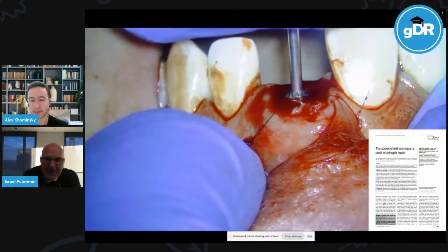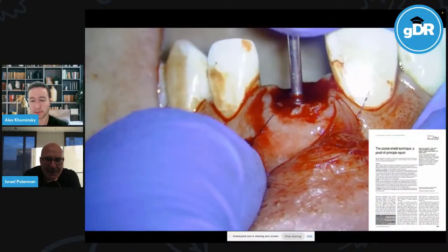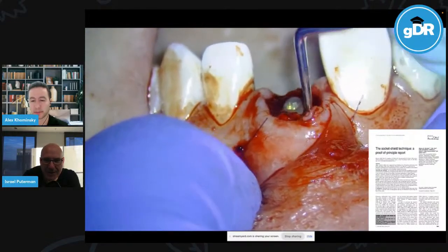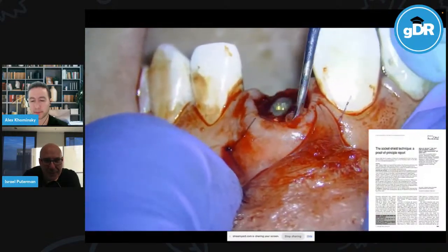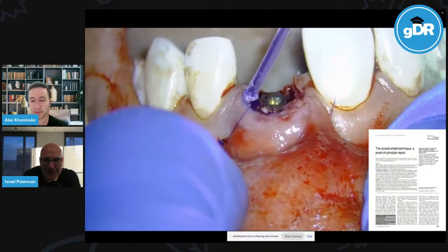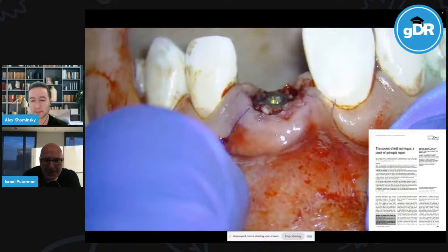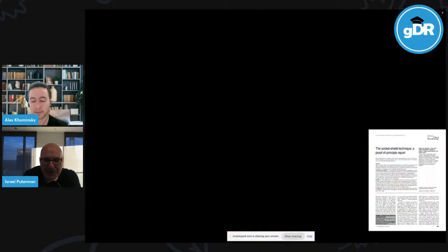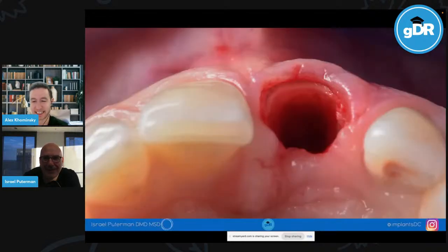And I place a healing abutment. I don't have a customized healing abutment. I didn't fabricate one. I fabricated a restoration, and a poorly made restoration at that. So that's just a little bit of periacryl to seal things off. And I say, okay, lab. At this point, I call my lab, and I probably was not very polite.